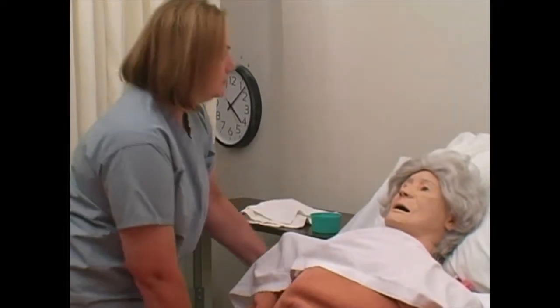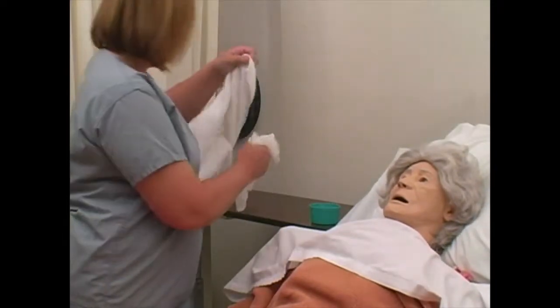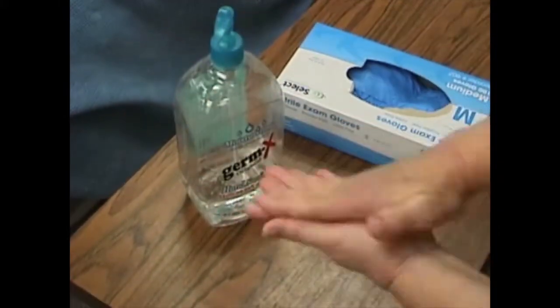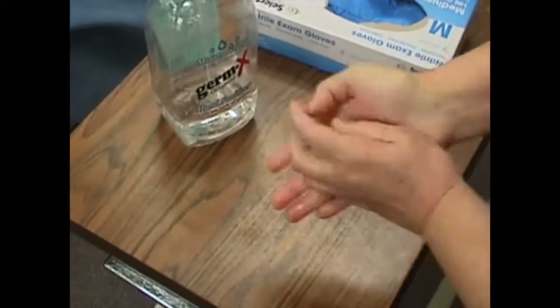Assure the person is in a safe, comfortable sitting position. Spread towel across person's chest. Decontaminate hands and put on gloves.